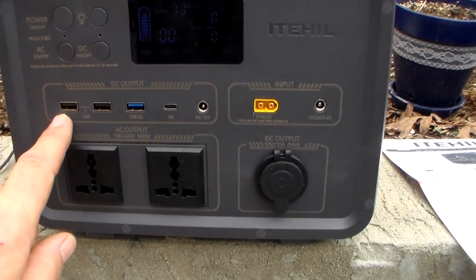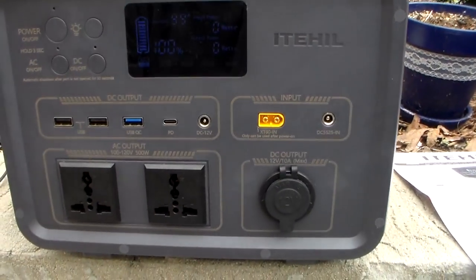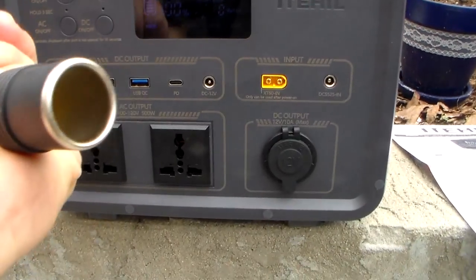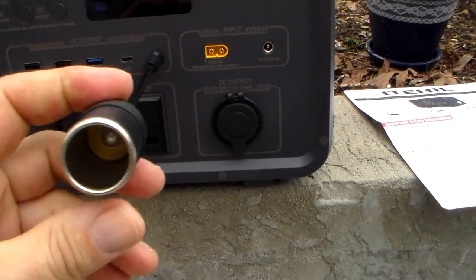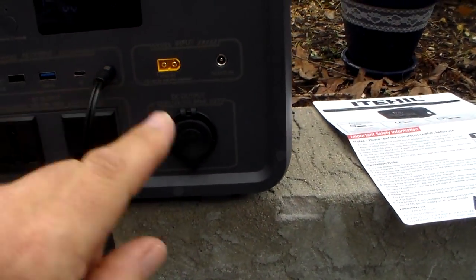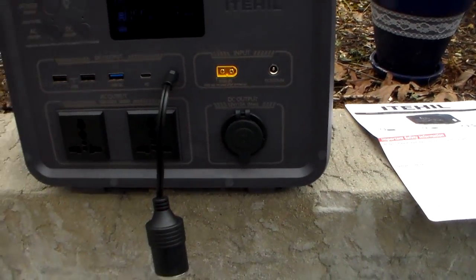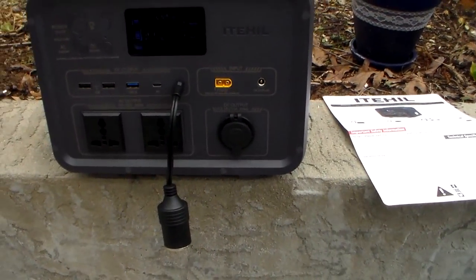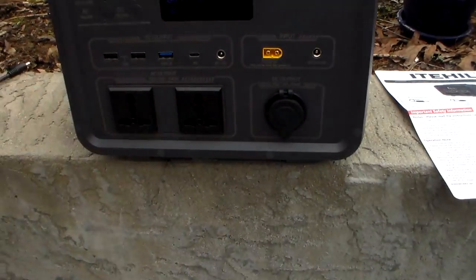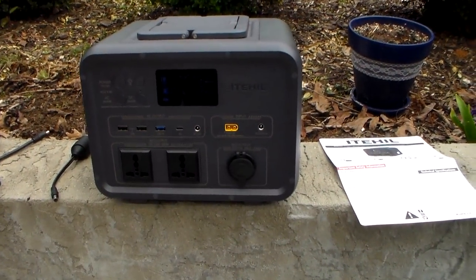It also has DC, and you have everything you're going to need to charge things from tablets to regular USB. You also have the adapter that comes with it so you can use two cigarette lighter-type products — they're 10 amps. For a CPAP machine, I would recommend using the DC side because you won't be running the inverter, so it's a more efficient use of your power.